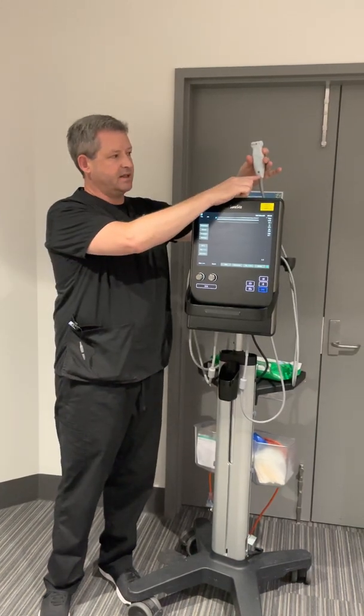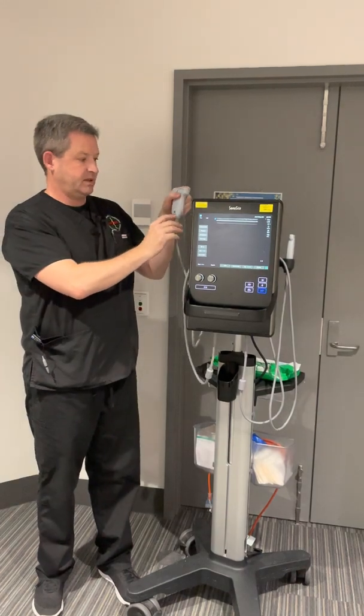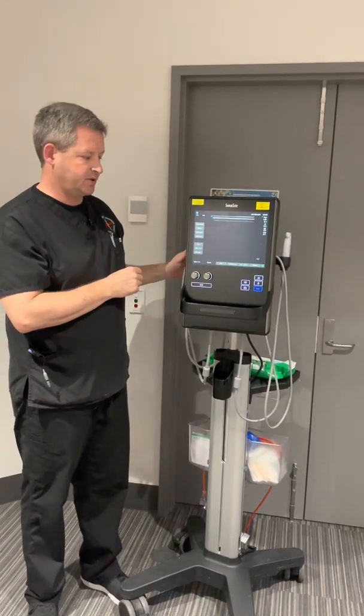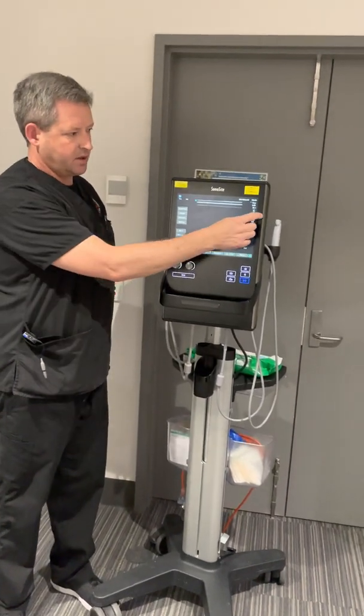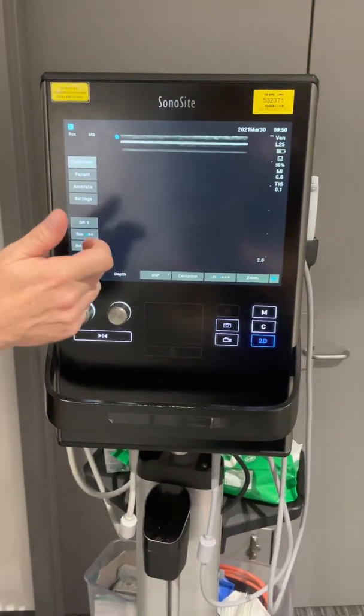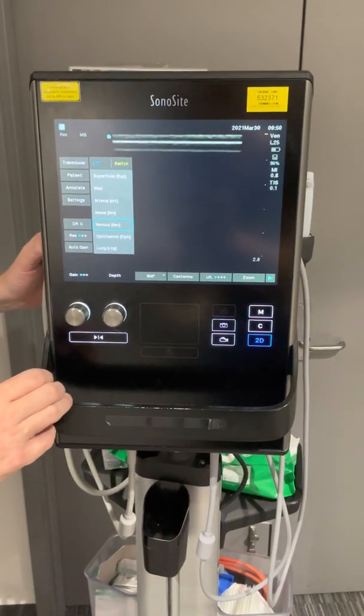At the bottom of the transducer you can see the name of the transducer — so this is the L25, and this would be the HFL50. To swap between transducers, you can currently see where the transducer is selected on the L25. To swap transducers, press the transducer button and it'll show that it's currently on the L25.